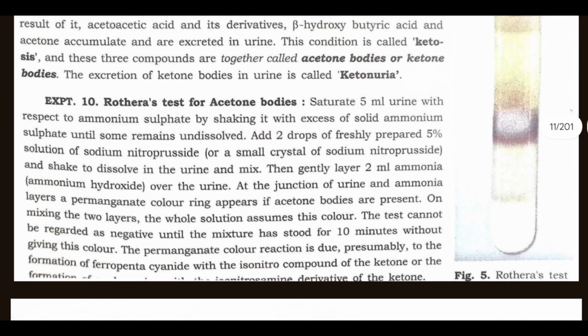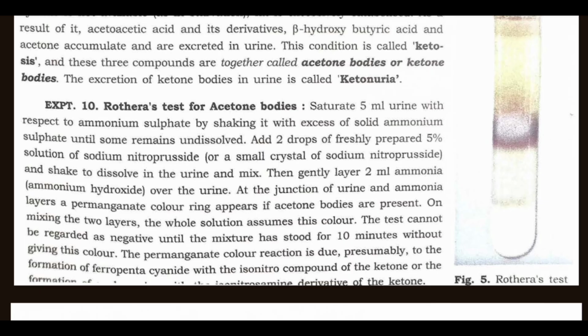Experiment number 10. Rothera's test for acetone bodies. Saturate 5 ml urine with ammonium sulfate by shaking it with excess of solid ammonium sulfate until some remains undissolved.